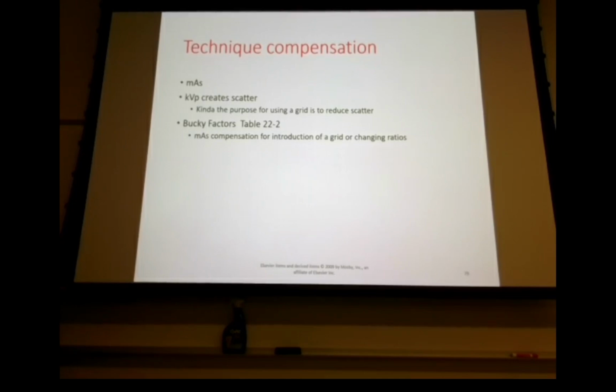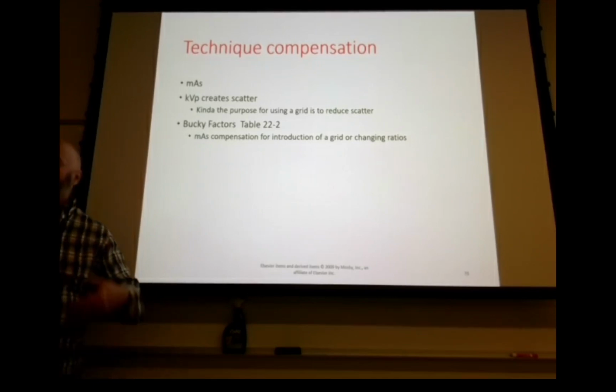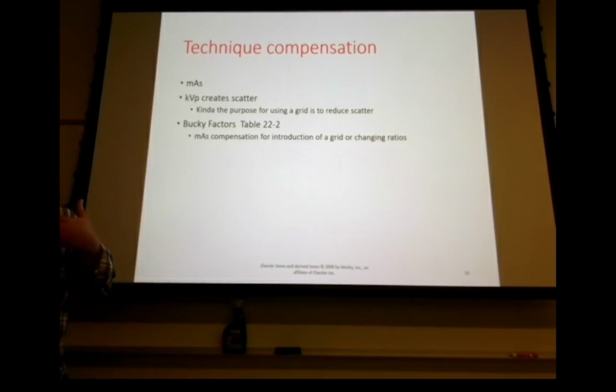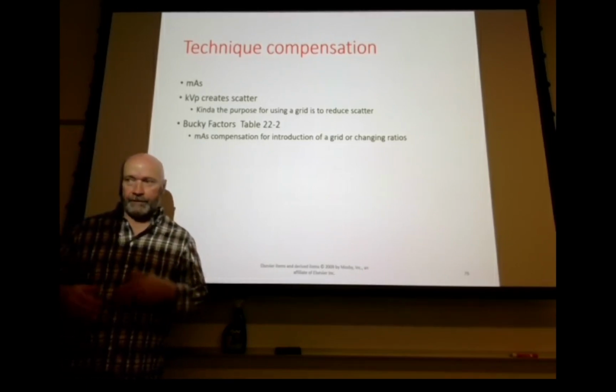So even though they put in a portable KUB, do you shoot a KUB for feeding tube placement? The answer is no. You shoot somewhere between a chest x-ray and a KUB, right? So you might center more like an upright abdomen, as far as where your image receptor is.